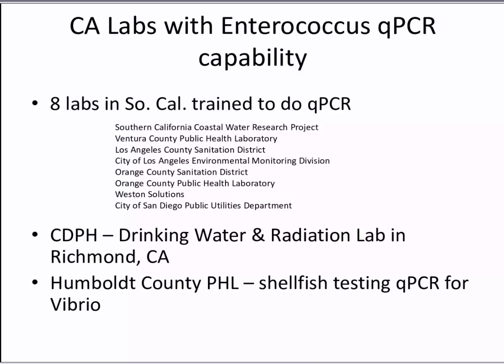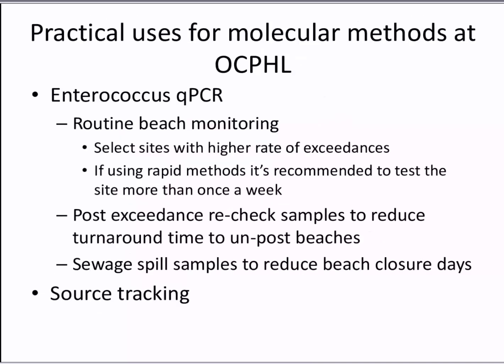And then, so practical uses. Like I said, it's been 5 years since EPA has approved the qPCR for routine monitoring. For us, I just don't think it's practical to do qPCR for routine beach monitoring. We have a total of 150 sites in Orange County that get tested once a week, and to try to run those routinely, I don't think it's going to happen.